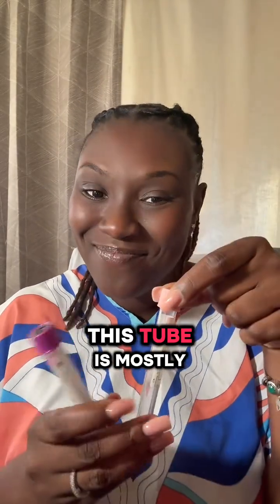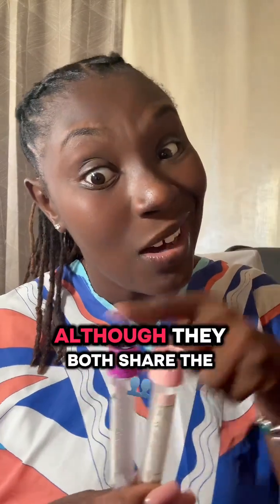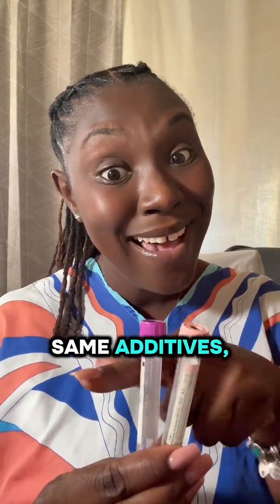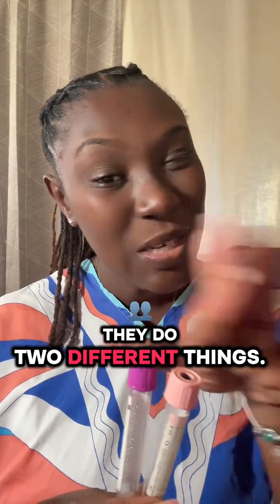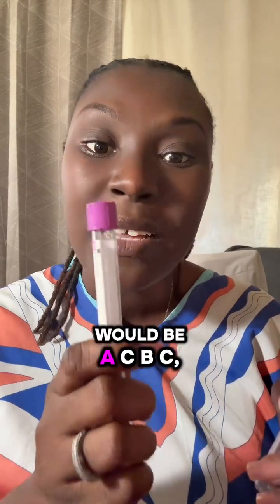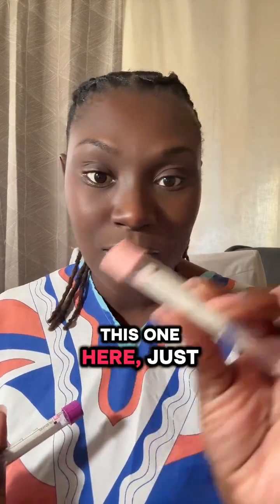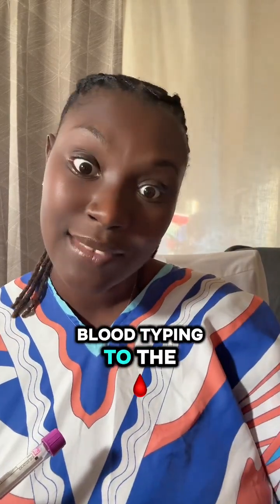This tube is mostly used for blood typing. So we would send this tube to the blood bank. Now remember, although they both share the same additives, they do two different things. The tests that are required for this tube would be a CBC, blood smear, ESR, and an A1C. This one here, just blood typing to the blood bank.